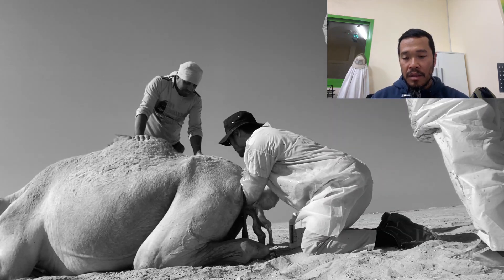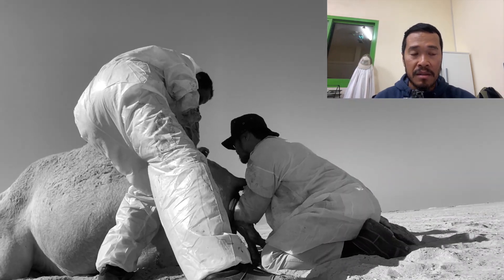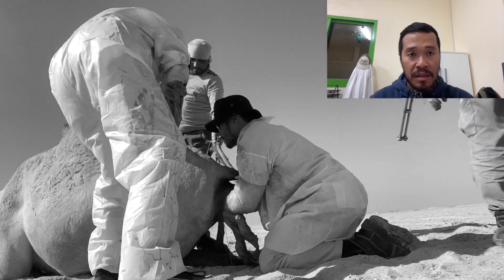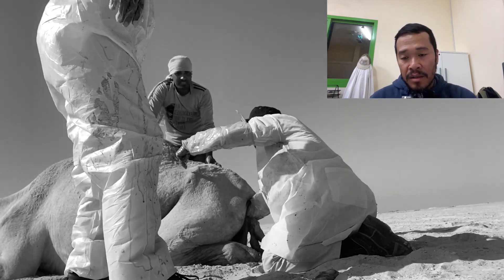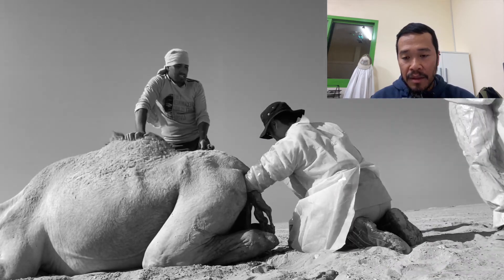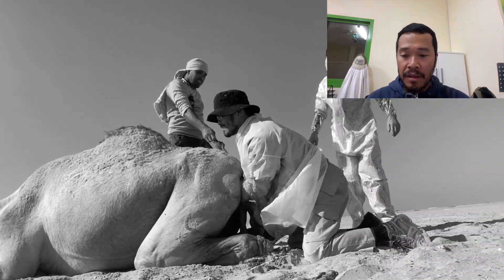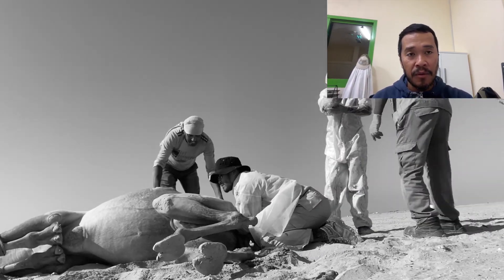This is not an easy procedure for us, the team, or especially the animal. For your information, the animal was not sedated — we simply restrained it properly. Here you can see me trying to pull the head and neck portion together — from the cervical area to the head — but it's still difficult with all four limbs sticking out.